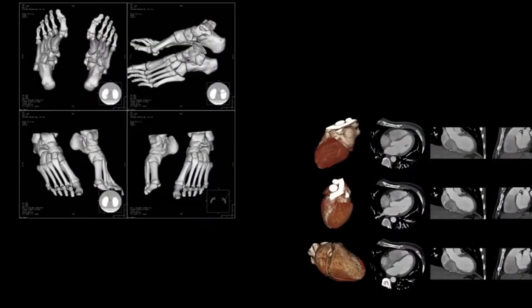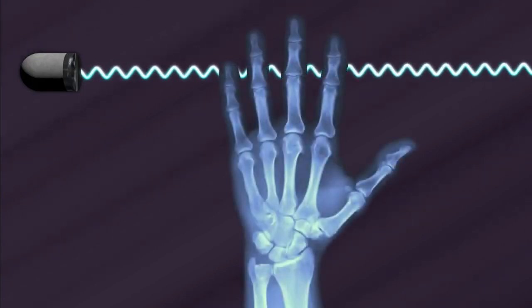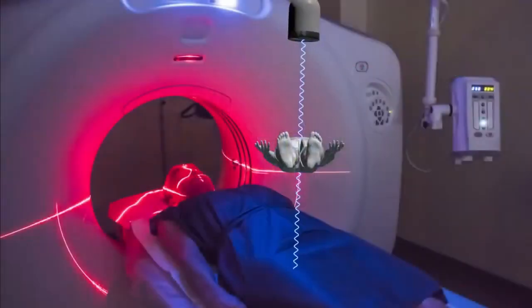The second type of CT scanner is single-slice CT machines. Single-slice CT machines are capable of acquiring one image per gantry rotation. The gantry is the ring the patient is placed in. A scanner with more slices allows faster acquisition.